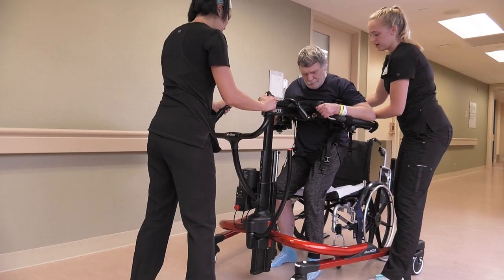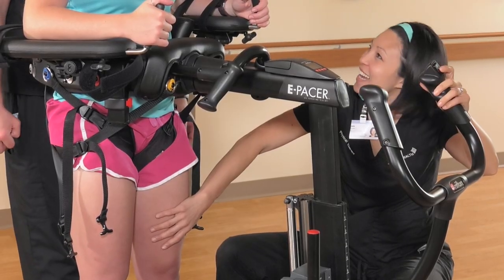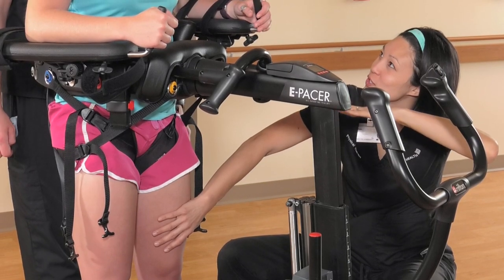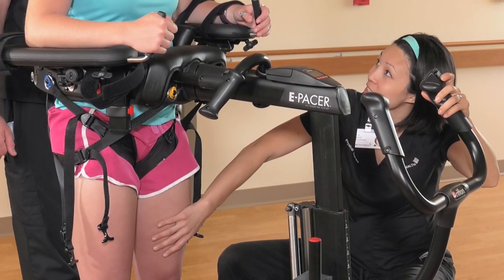Repeat as tolerated until the patient is fatigued and needs to sit back down in the chair. As a patient begins to engage quad extension and hip extension independently, reduce the facilitation from the therapist, only assisting when the knee buckles.